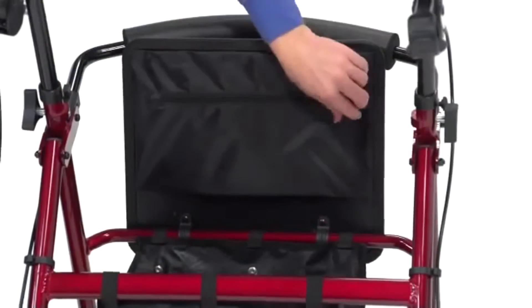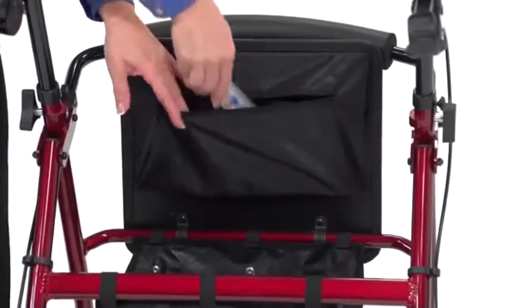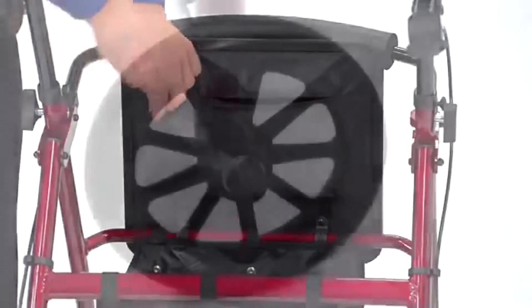And this convenient zippered pouch underneath the seat provides privacy and security when toting personal items.